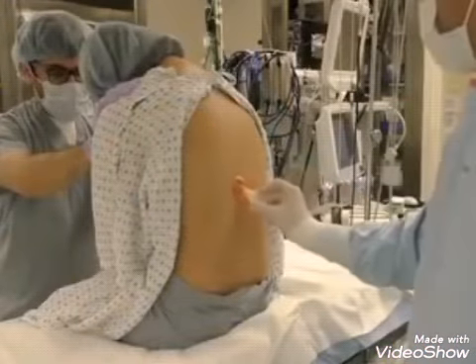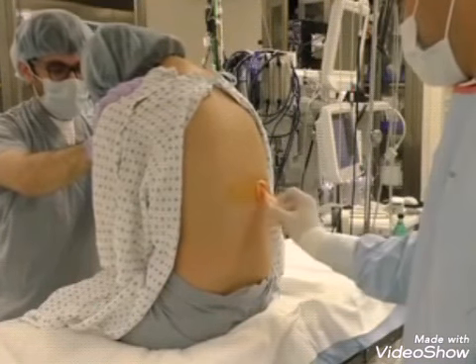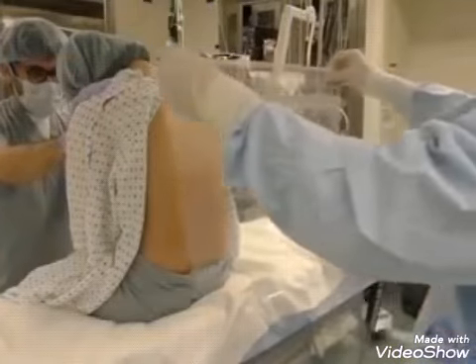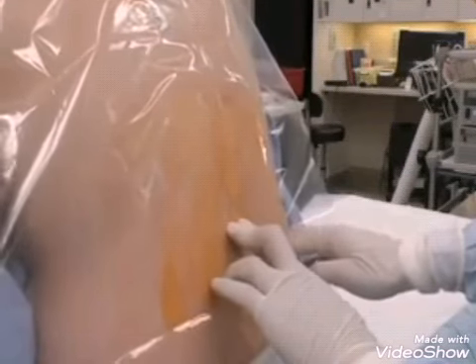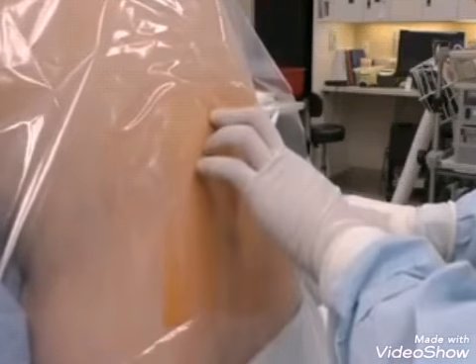Apply the antiseptic skin cleanser in a back and forth motion for approximately 30 seconds. Allow the solution to air dry for at least 30 seconds. Place the sterile drape over the patient's back so that the opening provides access to the planned site of catheter placement. The epidural catheter should be placed at a level that will provide anesthesia or analgesia for the particular procedure or for control of labor pain.